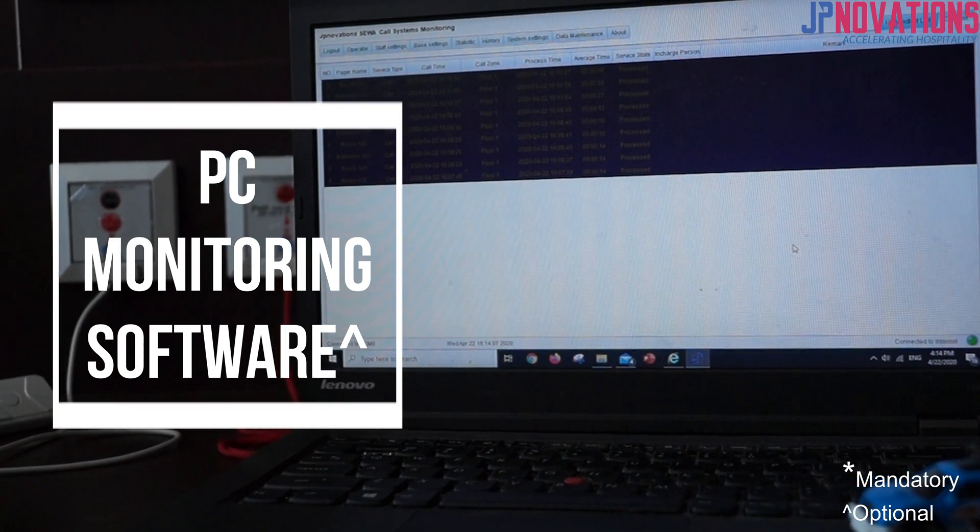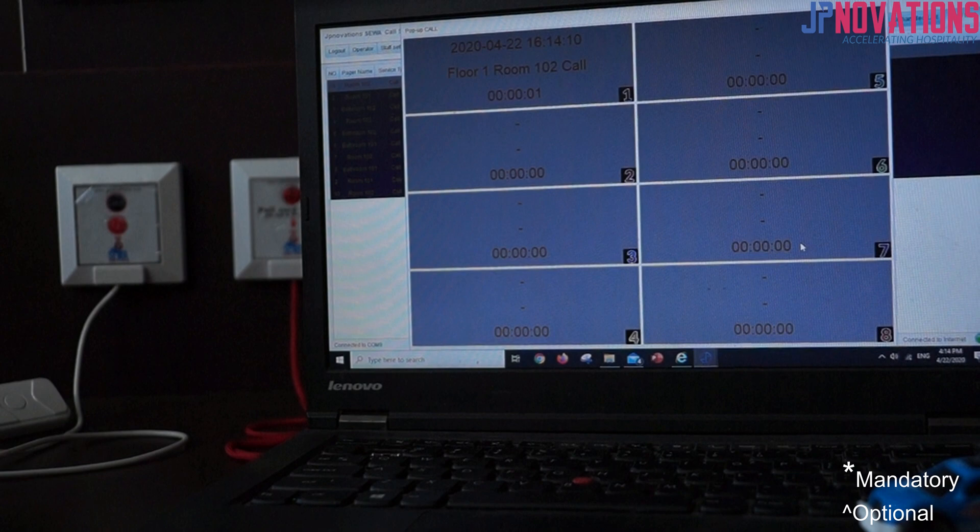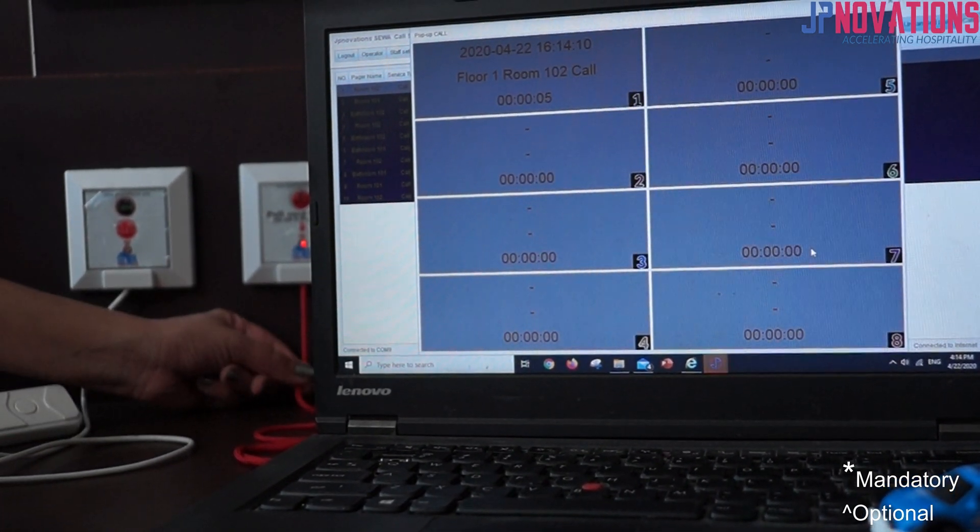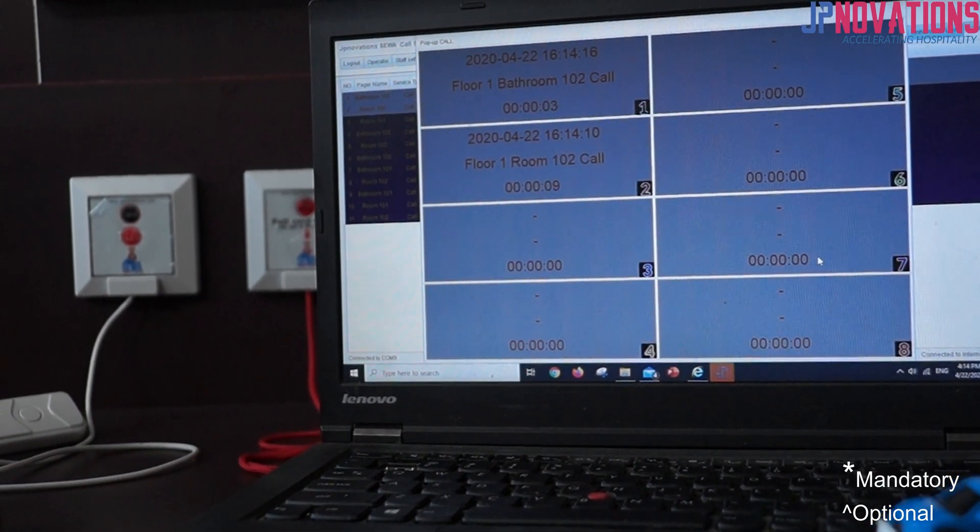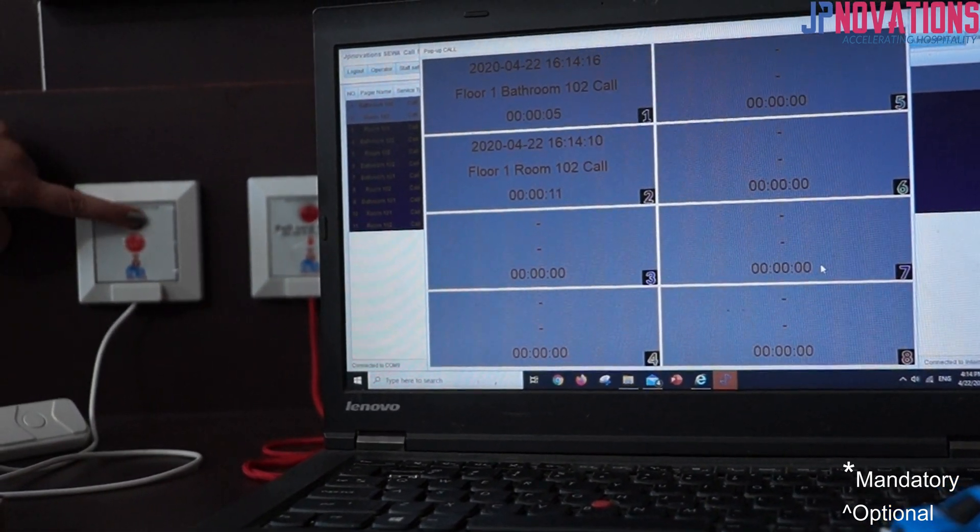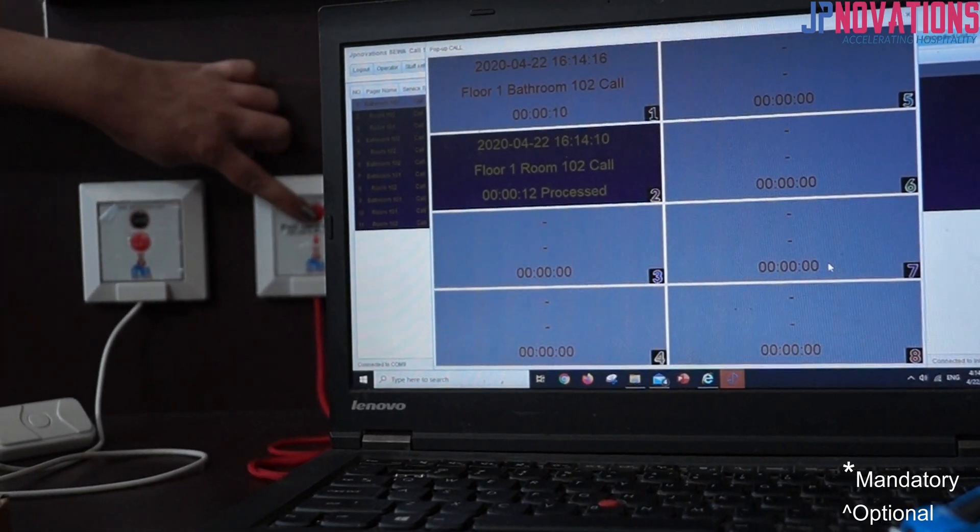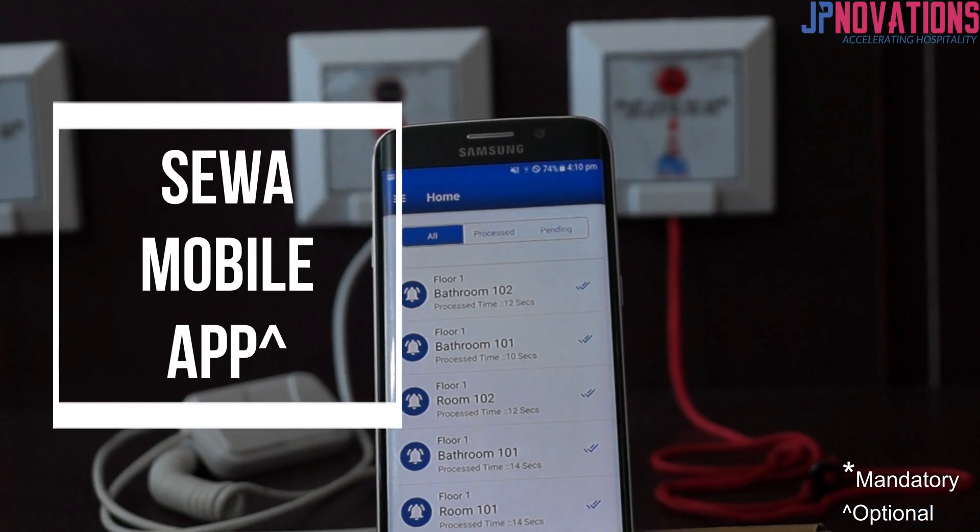Further, nurse panel can be connected to a PC to collect and monitor the call data. PC monitoring software also has various features like live call popper, store each call timing, color coding for delayed calls, extract data history, generate Excel reports and many more. You can check the full video of the software separately.